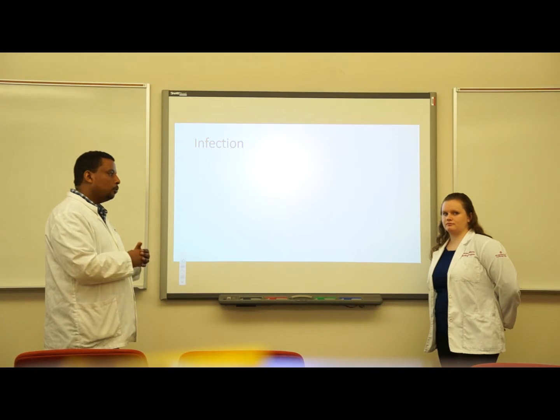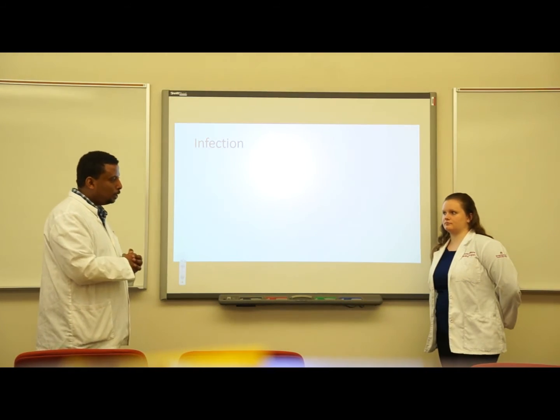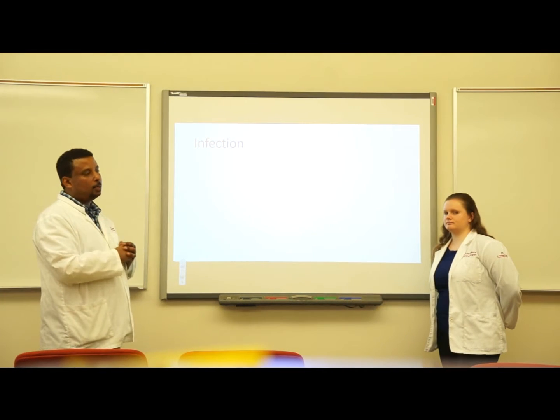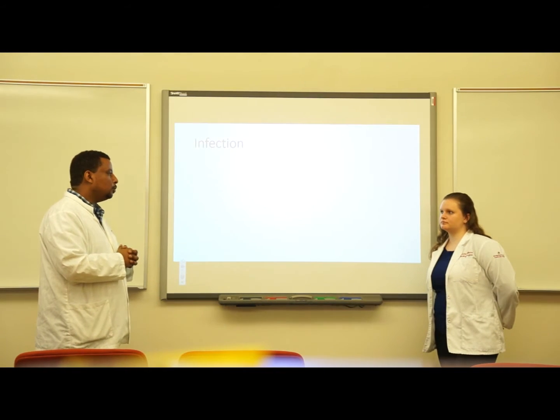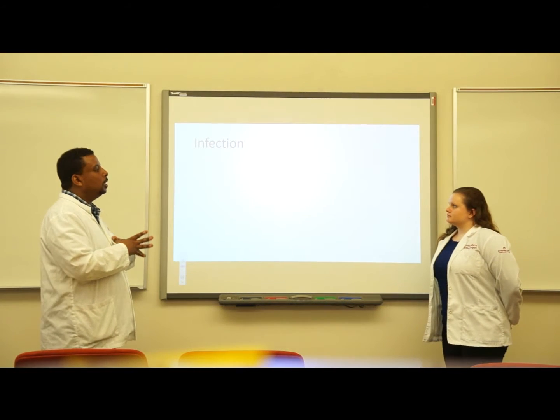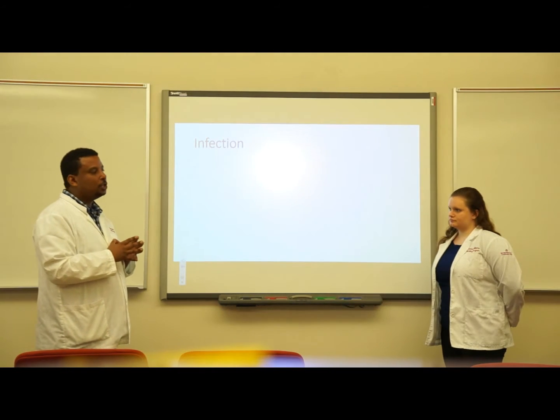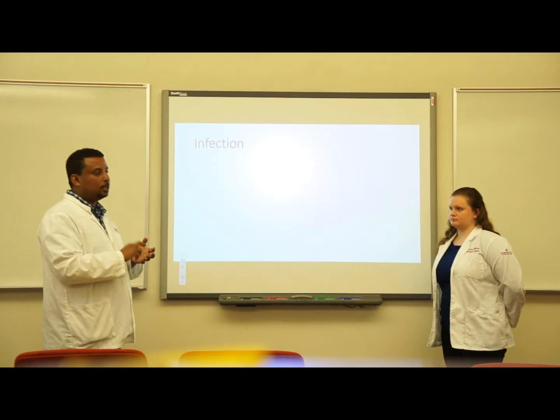The other thing we have to consider is we have implanted a foreign body in our patients, the device. And whenever we have a foreign body in the patient or in our system, that predisposes us to infection. So it is really, really important for us as nurses to make sure that the patients are free from infection and that we educate them to make sure that they know the signs and symptoms.